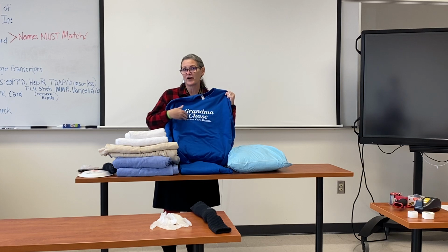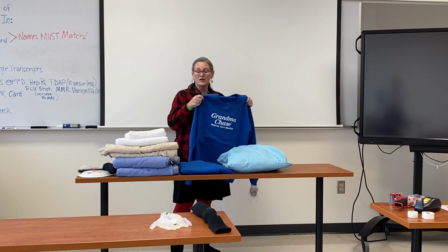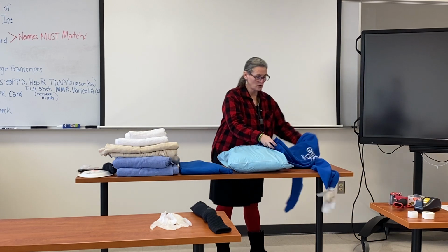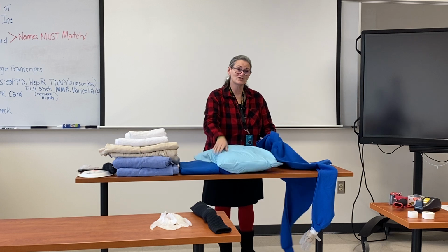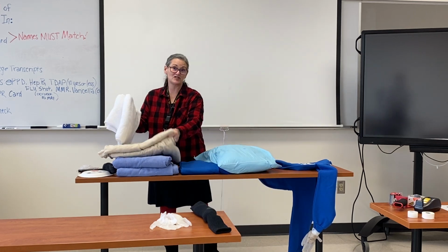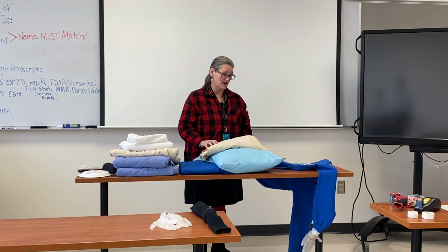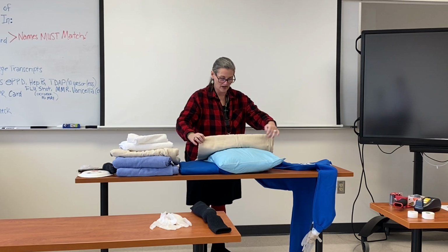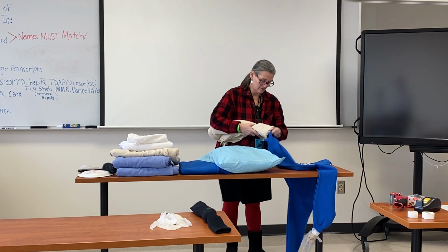And I'm calling it Grannykin because we have Grandma Chase patient care manikin sweatsuit. So the first thing you would want to do is take your pillow and stuff it up in the shirt. No, actually, back up. You're gonna need your beach towels because you gotta make arms first. And it's easier to stuff the arms with the beach towels if the pillow's not in the way. So just fold them till you got a nice long roll.